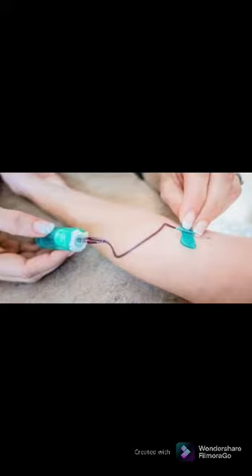Reapply the tourniquet, uncap and insert the needle. Anchor vein and insert the needle. Establish blood flow and release the tourniquet. Fill, remove, and mix tubes in order of draw. Place gauze, remove needle, activate safety device, and apply pressure.